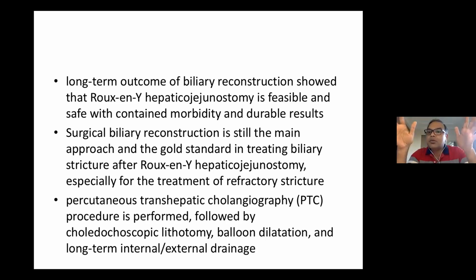So we should also follow the gastroenterologist protocol, that multiple internal external drains are required to keep the hepaticojejunostomy dilated, for a time of 9 to 12 months, so that remodeling occurs during this period. That will be the best scenario when you are offering the best treatment to the patient. So it's not that you just put one single internal external drain. The more internal external drains, the better the results will be. And you have to keep changing them every 3 months till a year.